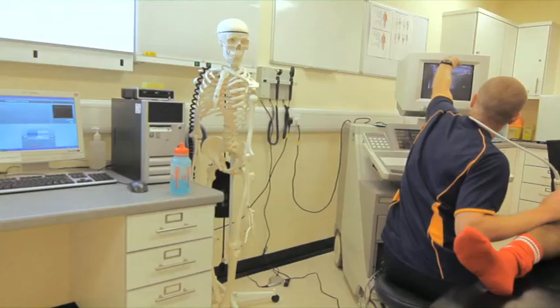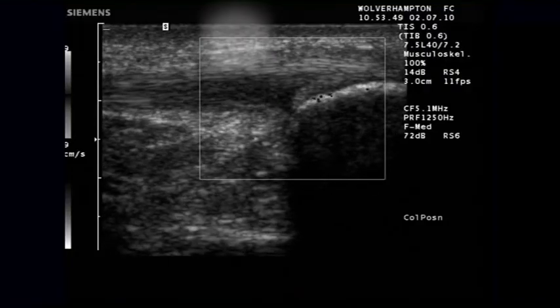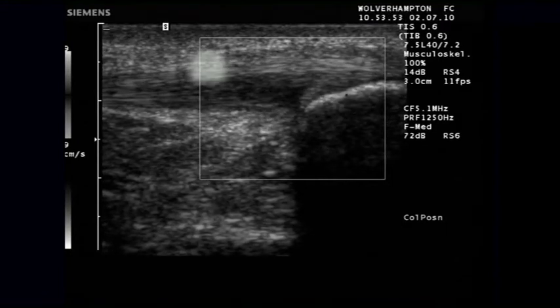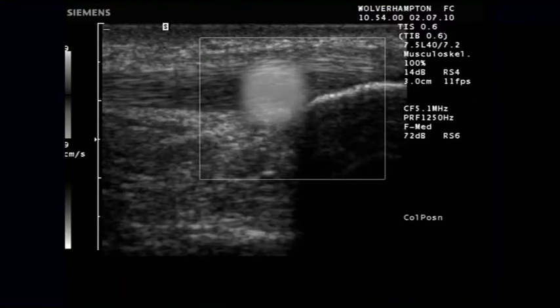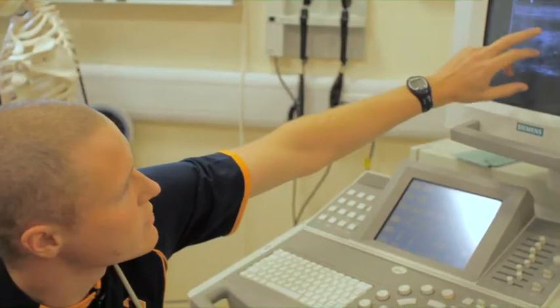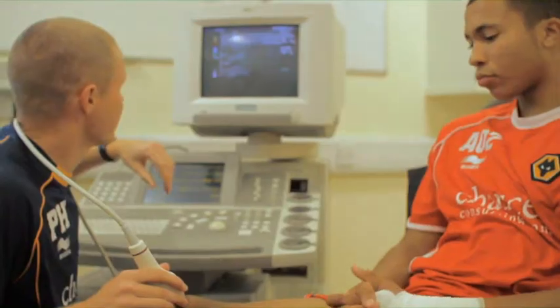The transducer will be up there looking down, so here's his skin, subcutaneous fat layers, the kneecap there, which is the sort of lighter area, and then his tendon is this nice sort of grainy longitudinal tissue there. And this sort of darker area is where Sam has a bit of a problem with his patellar tendon, whereby through overuse he's just had some inflammation there. It's become a chronic problem, and he's now got poor quality tendon tissue in there.